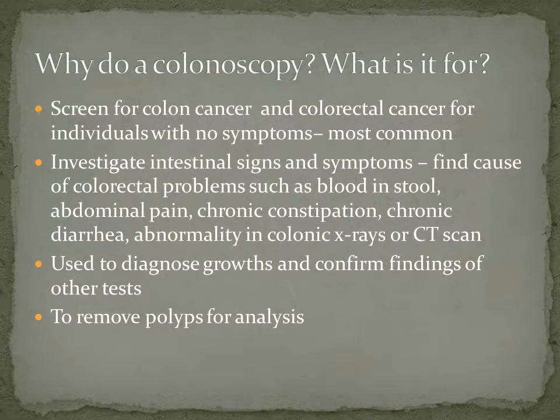Colonoscopy is done for several reasons. Most colonoscopies are performed as part of screening for colon cancer and also for screening colorectal cancer in people who have no symptoms. It is done to investigate the cause of blood in stool, abdominal pain, chronic constipation, chronic diarrhea, and a change in bowel habit or an abnormality on colonic X-rays or a CT scan.